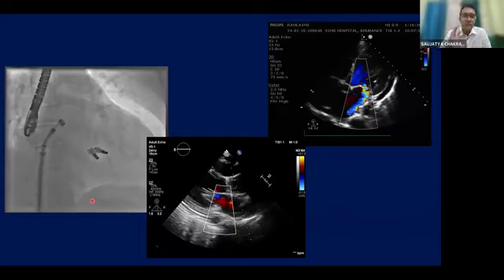In TCT, they presented this Sapien M3, the ENCIRCLE trial. They are for non-MAC valves. The Sapien M3 has come up, and you can then put an encircling device. I saw the trial being presented. As usual, they say very exciting. All the results are very good, but I don't know actually. When you travel to Europe and you see a mean gradient of 25 across the aortic valve being treated with TAVR, realize that there is more to it than that.